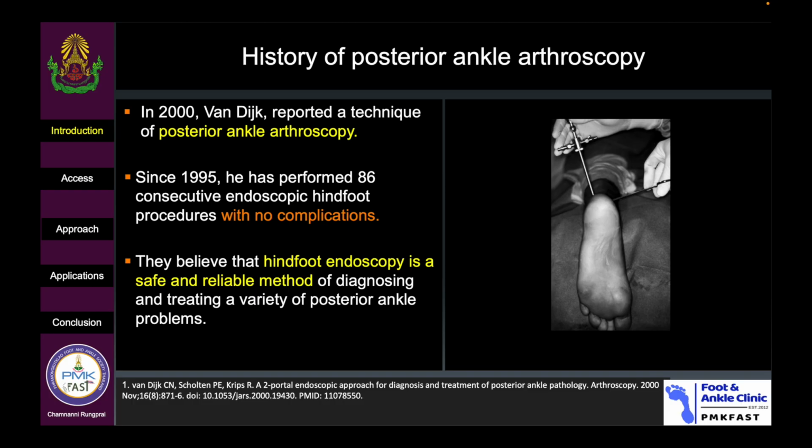In 2000, van Dijk and his team reported a technique of posterior ankle arthroscopy. Since 1995, he has performed 86 consecutive endoscopic hindfoot procedures with no complications, and they believe hindfoot endoscopy is a safe and reliable method for diagnosing and treating a variety of posterior ankle problems.